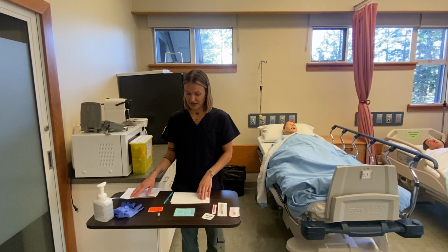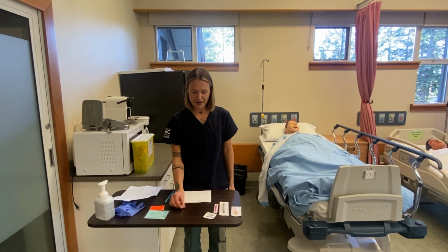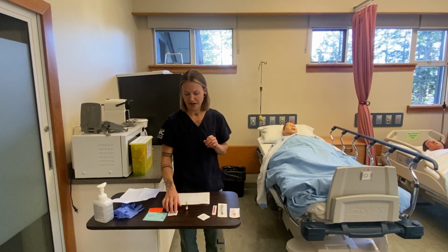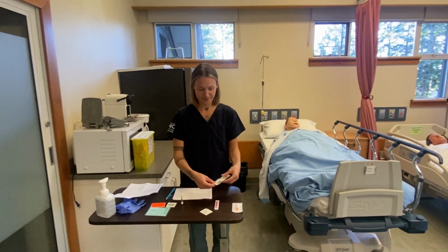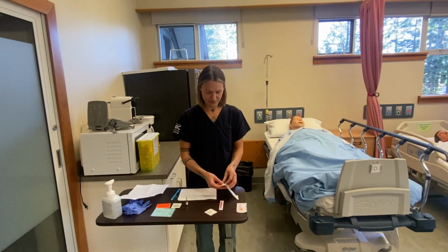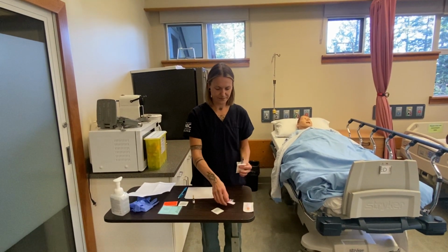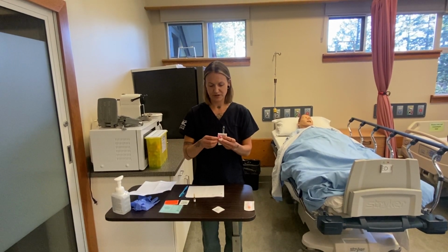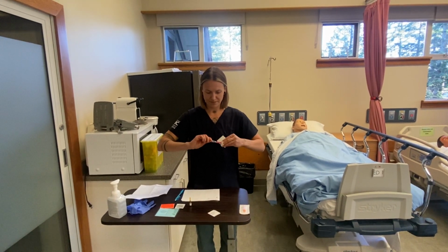So the next thing I can do is draw up the med. So I'll just make sure there's no air in there. And then I will use, actually I will do that separate. So first thing I'll do is get my syringe. And then I'll get my filter needle, put that on top.